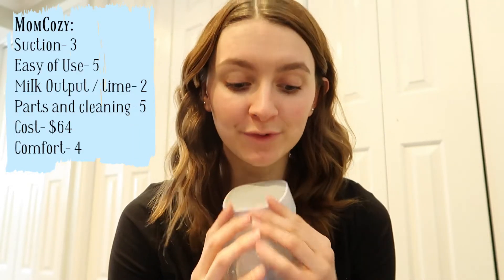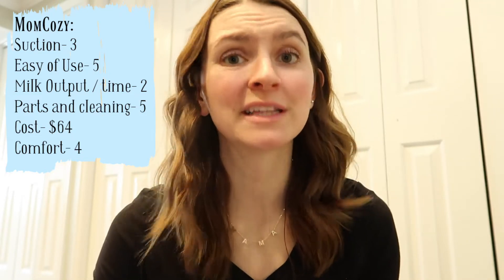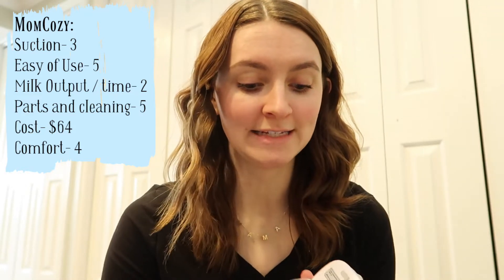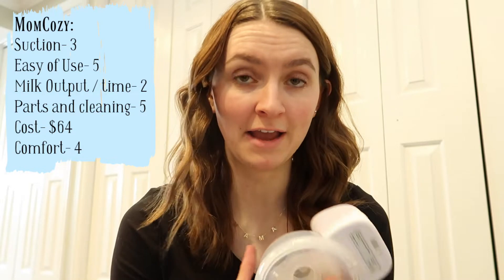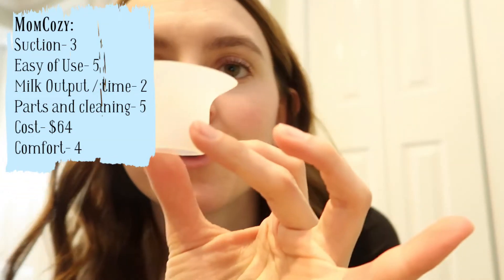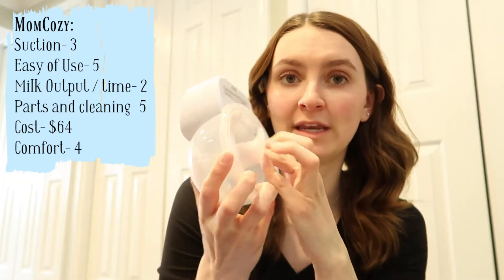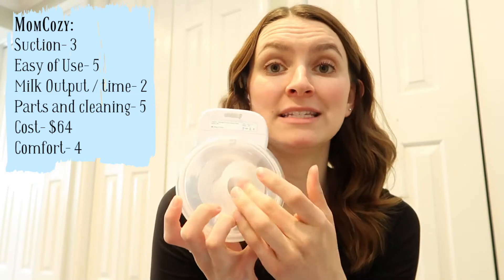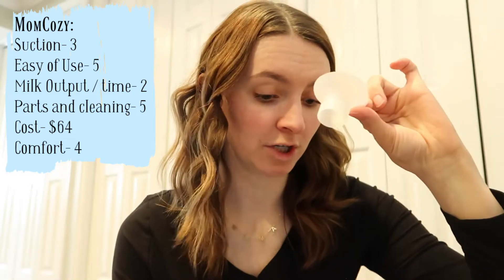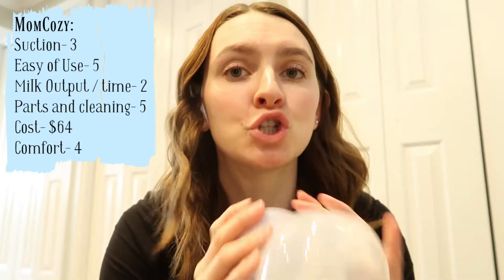For the Mom Cozy, suction is a three. The reason is that compared to some other pumps, these others can do some serious suction. Also, a lot of these other pumps come with a little additional flange insert that goes inside the pump — the Mom Cozy does not come with one. If you want one for the Mom Cozy, you have to buy it separately.